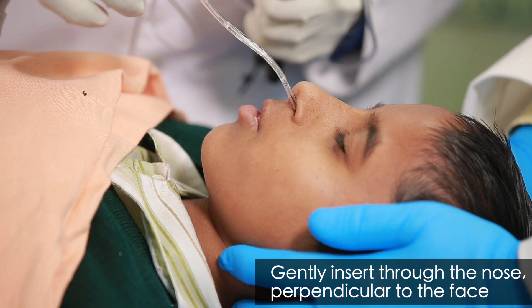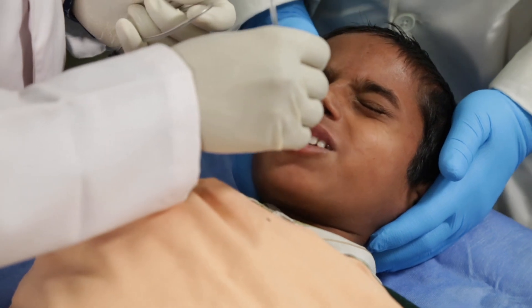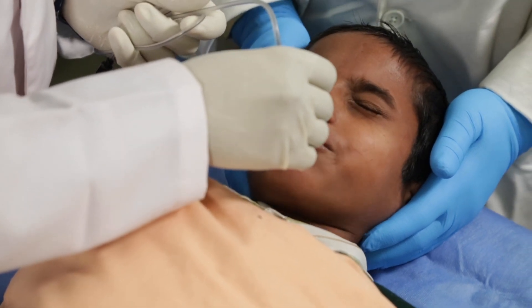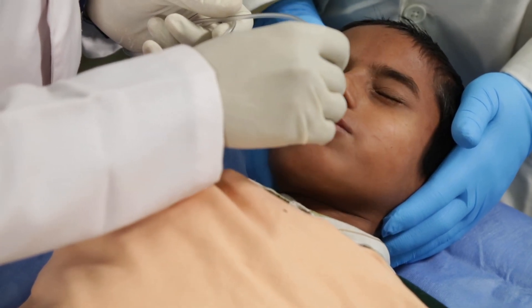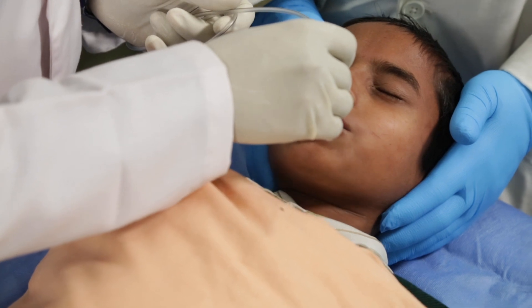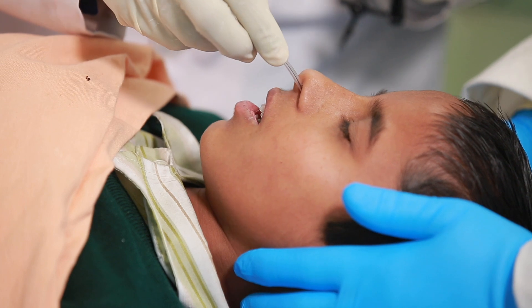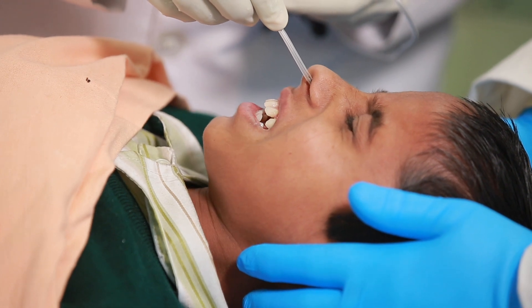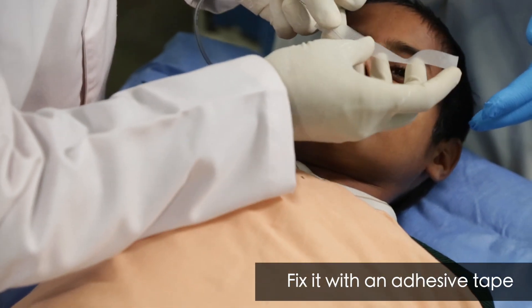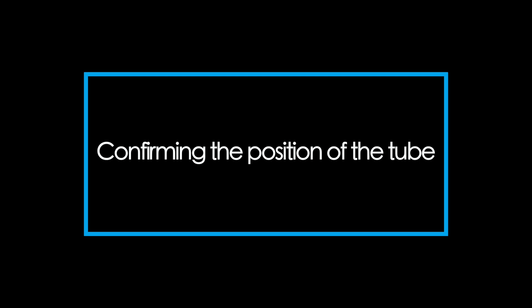Gently insert the tube through the nose in a direction perpendicular to the face, up to the measured length. This can often be assisted by asking the patient to swallow. Fix it to the nose with an adhesive tape.